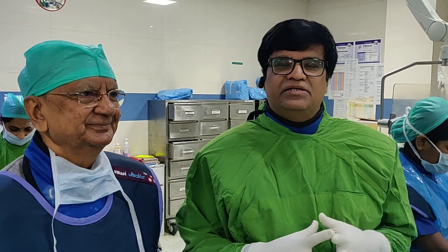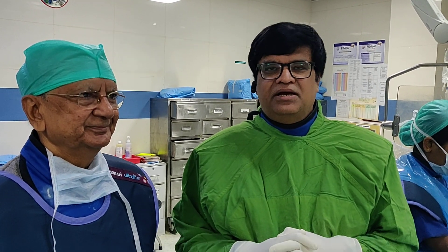Dr. S.K. Gupta will tell us the technical part of this BMV. She is a young 20-year-old female who had severe critical mitral stenosis with a valve area of 0.8. The commissures were slightly fused but there was no major calcification and echo showed mild mitral regurgitation. We discussed with Dr. S.K. Gupta and agreed that we will do a sub-optimal BMV with care, without taking much risk.